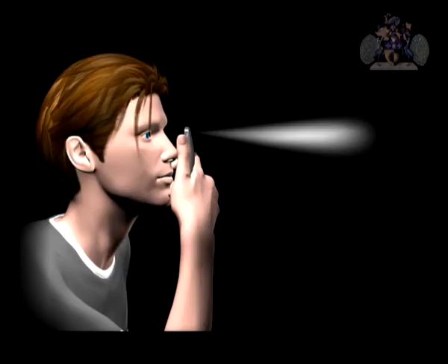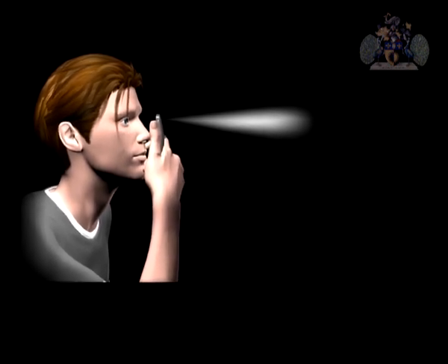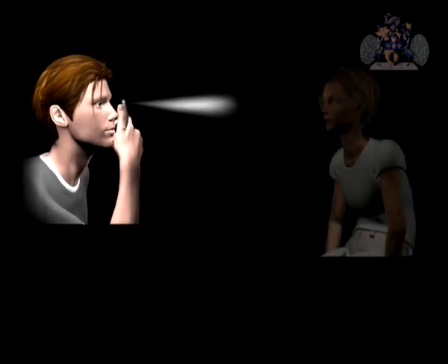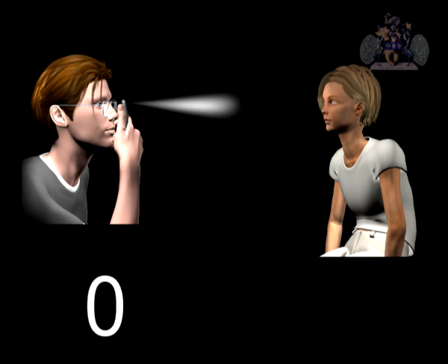It is important to note that the examiner needs to factor in their own refractive error if they choose to remove their own distance spectacles. If the examiner is wearing contact lenses or distance spectacles, the refractive error from the examiner's side is effectively 0. Should this be the case, the only refractive error that needs to be kept in mind is that of the patient. The patient must remove their spectacles in order to allow adequate proximity and as wide a field of view as possible when looking at the patient's fundus.